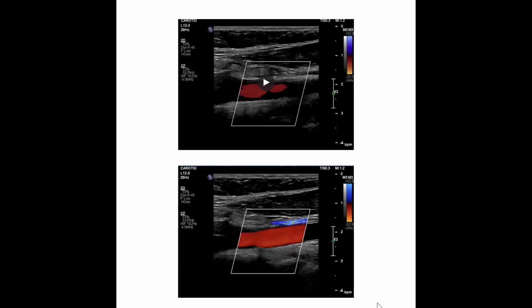And so what we are seeing in this image are frames created over time being layered with one another. So we're really getting a lot more information from that color Doppler. It's all getting layered on one another. So we see a lot more color fill within the picture. And that is because it's averaging those frames together, showing us what the true signal is versus just one moment in time.